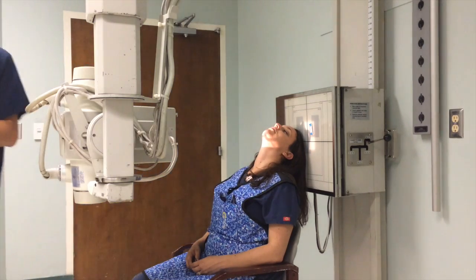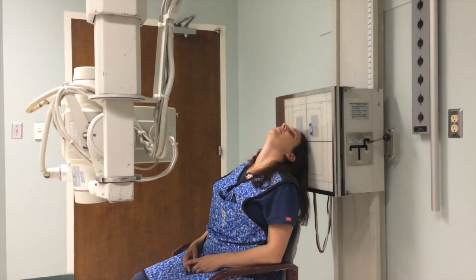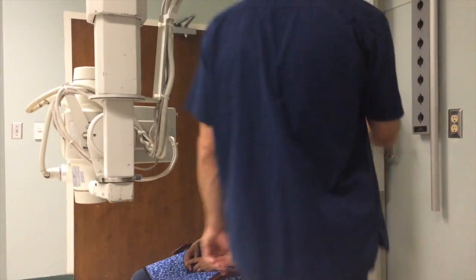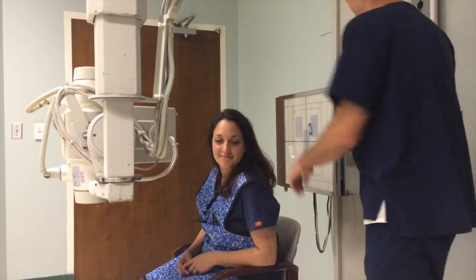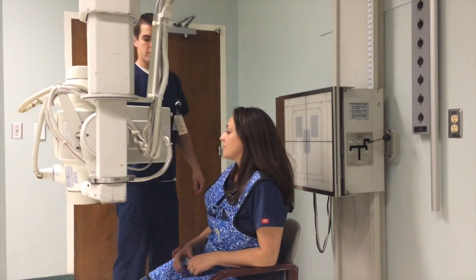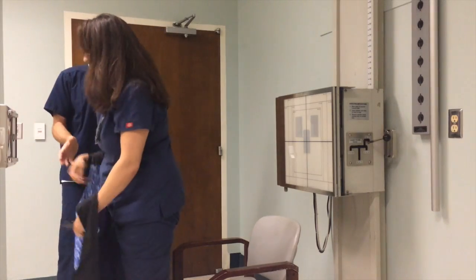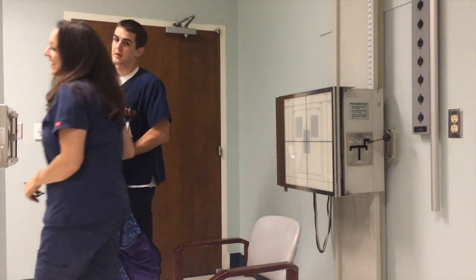All right. Hold still. Beep. Alright, Marissa, so that should be it. Relax. Let me just go run these, make sure you got everything the radiologist wants to see. Looks good, so if you want to just go ahead and hop up, we will get the lead back from you. It's not a souvenir. And if you want to step right this way.